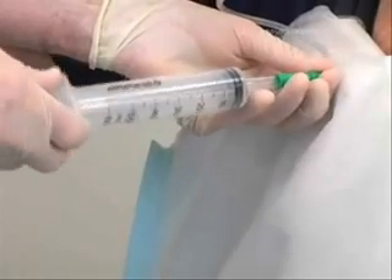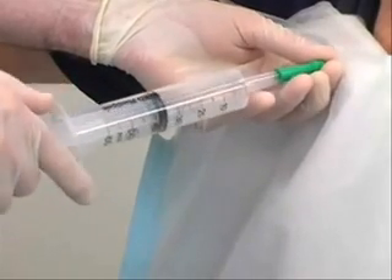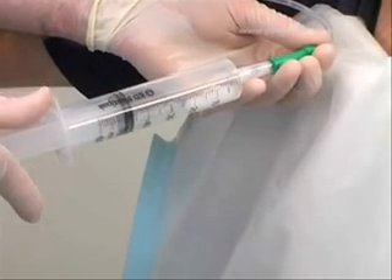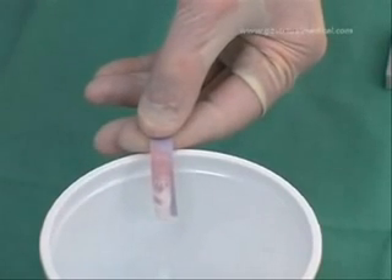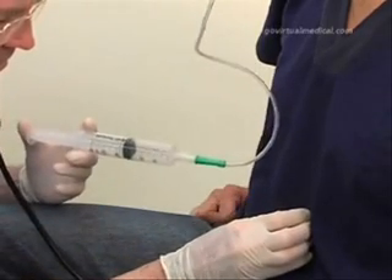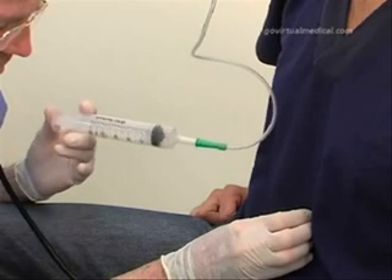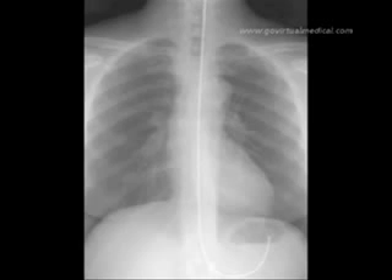Confirm the position of the tube by aspirating with the Tumi syringe and checking the pH of the contents — the contents should turn the blue litmus strip red. An alternative method of confirming position by listening over the epigastrium for a bubbling or gurgling sound while insufflating air through the tube is falling out of favor as it is not very reliable. If there are any doubts regarding the position of the tube, confirm it with a chest x-ray.